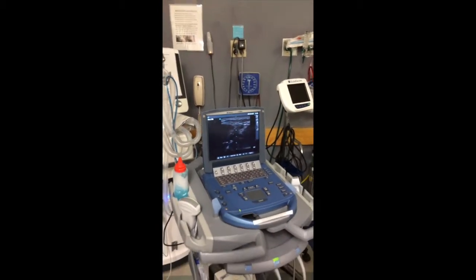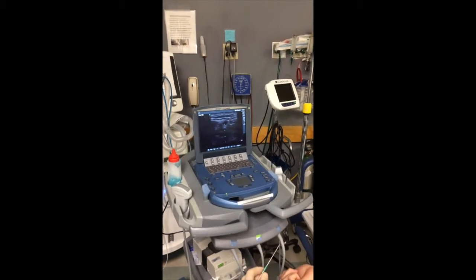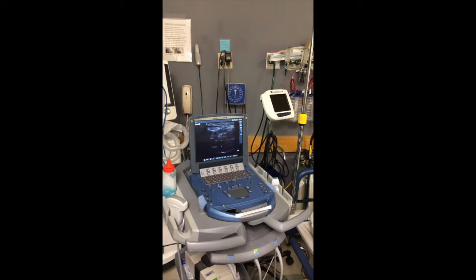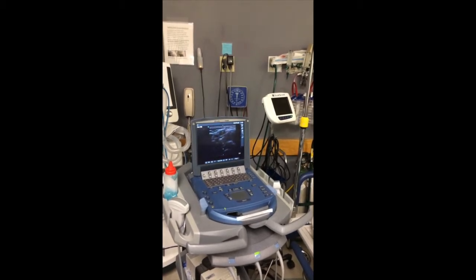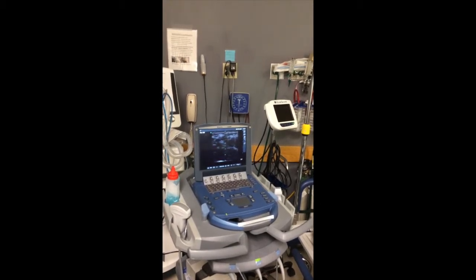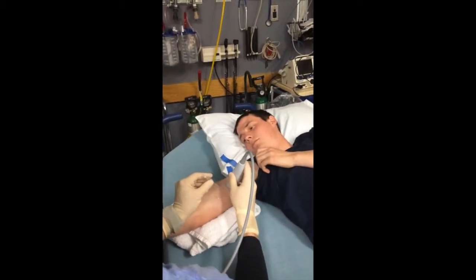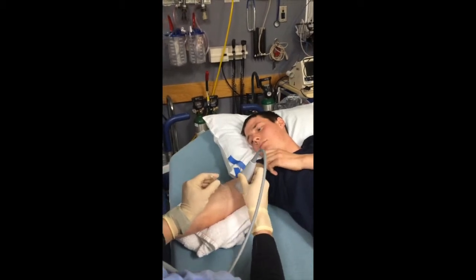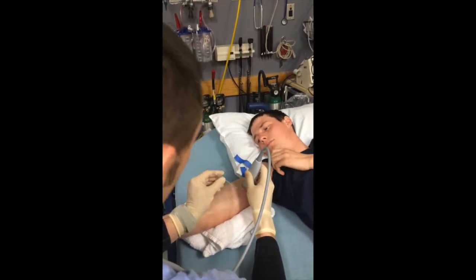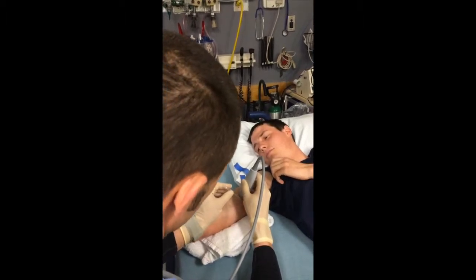So now I'm going to grab the IV, and I'm going to do this two ways. Right now I'm looking at it cross-sectionally, and this is the way I insert the IV. Then, just before I puncture the vein, I twist to a longitudinal look, and this allows me to see the actual catheter float into the vein. You want to come in on a bit of a steeper angle. This vein is somewhat shallow — it's only about a half centimeter deep, so I don't have to come in that steep. The deeper the vein, the steeper the angle you want to come in. Usually come back from the vein about the same distance down, so you want to be about a half centimeter back.